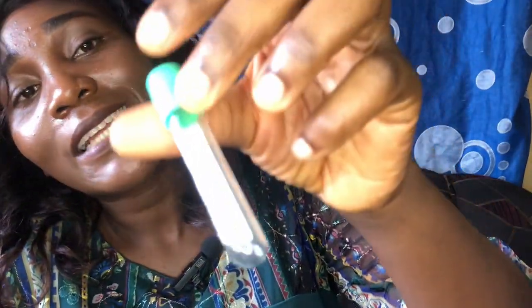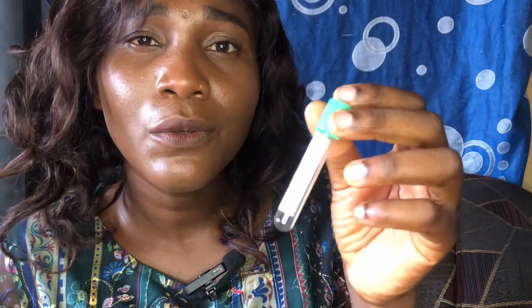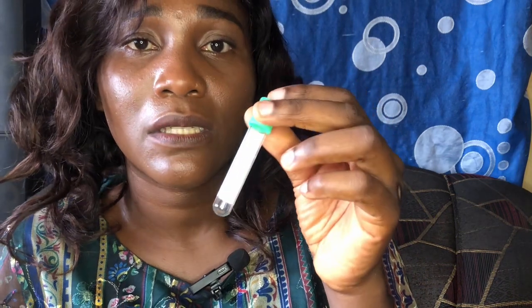When you collect the sample, you make sure you place it in an ice bag. When you collect this sample for maybe your lactate level or ammonium level, you place it in an ice bag and immediately send it to the lab so that the value of this sample can remain in its original state. In an ice bag, the value of the blood will be retained, and your test will be sent to the lab and worked upon.